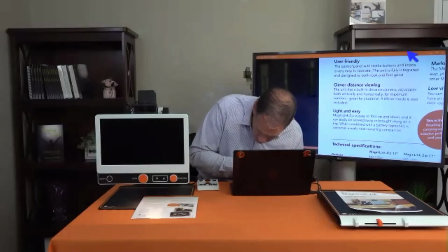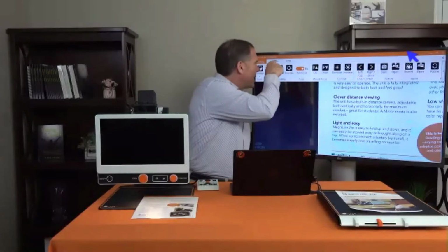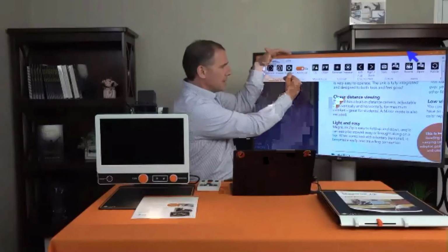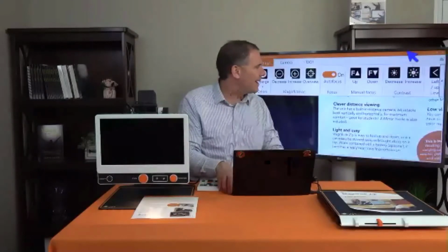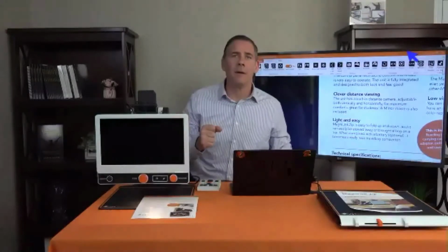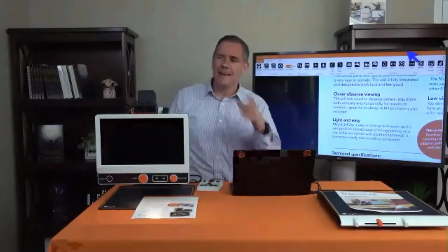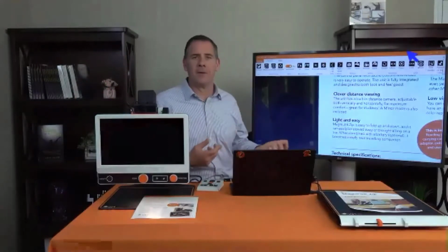But I am going to hit Control-H, and I'm going to show you the functions of it. I have camera and OCR. Those are 2 different modes. Now you can see, I don't know if y'all can, but if I couldn't see, which I really can't, I can enlarge this box by hitting Control plus, I hope, if I remember right. Oh yeah. And then Control minus makes it smaller. And then Control-H hides the menu. I want more real estate on my computer screen. When you're plugged in, this goes dark because you're not going to be looking at 2 screens with the same information. Kind of what I'm doing now. It's a little confusing.